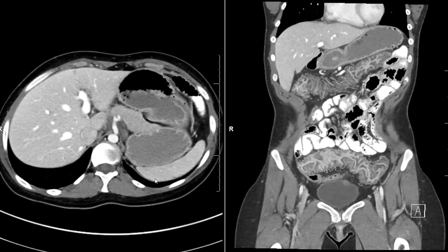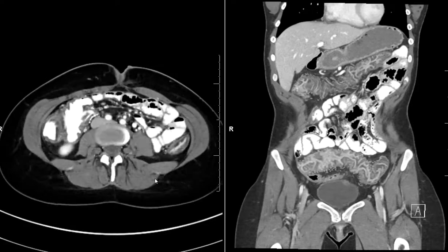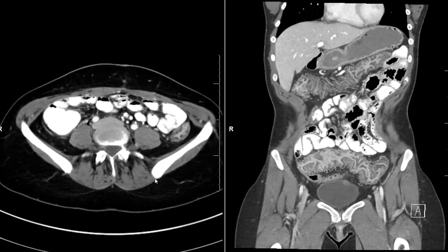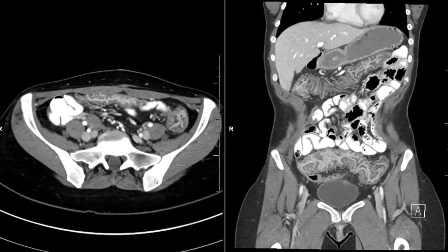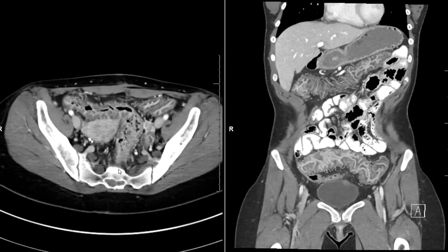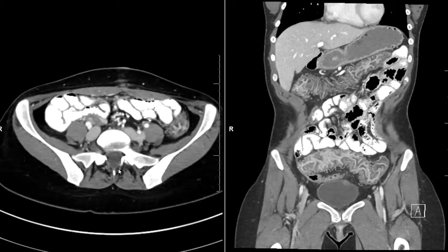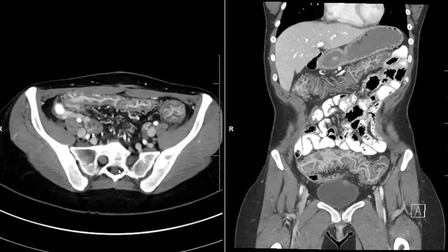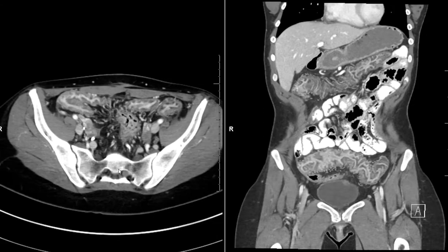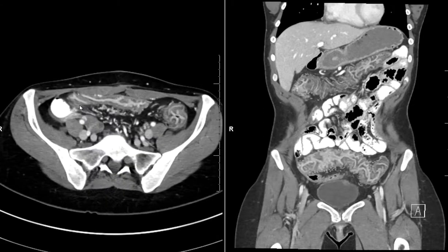Axial CT scan in a patient 25 years old, with a history of pelvic desmoid which was resected — there is no recurrence. But interestingly, the colon is very abnormal.